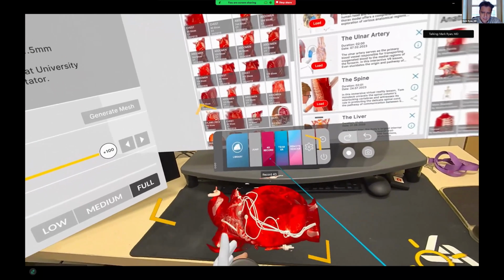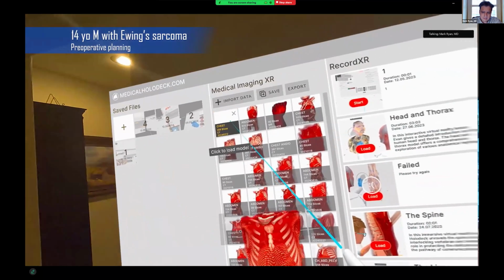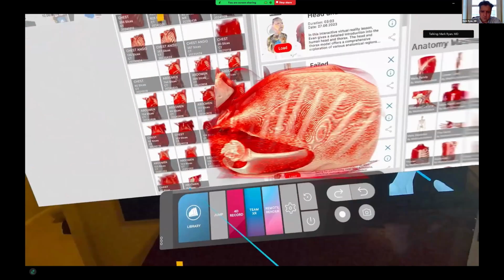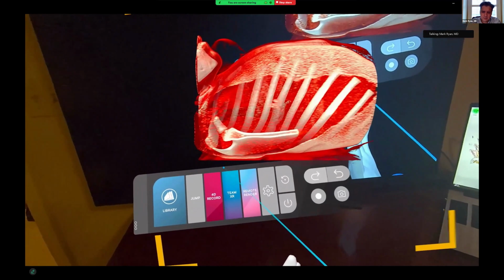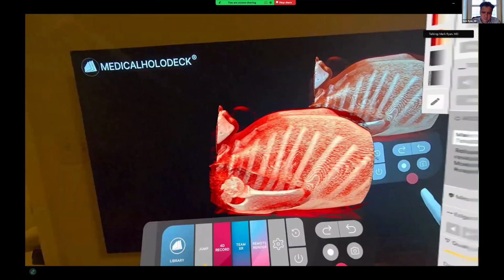I can go from nothing to VR in less than 5 minutes, and the longest part is downloading the DICOM files. So if that gets integrated, that'll be very helpful. The thorax is nice because you have lungs there for contrast, and bony structures are great to look at in VR just because you can see them really well.